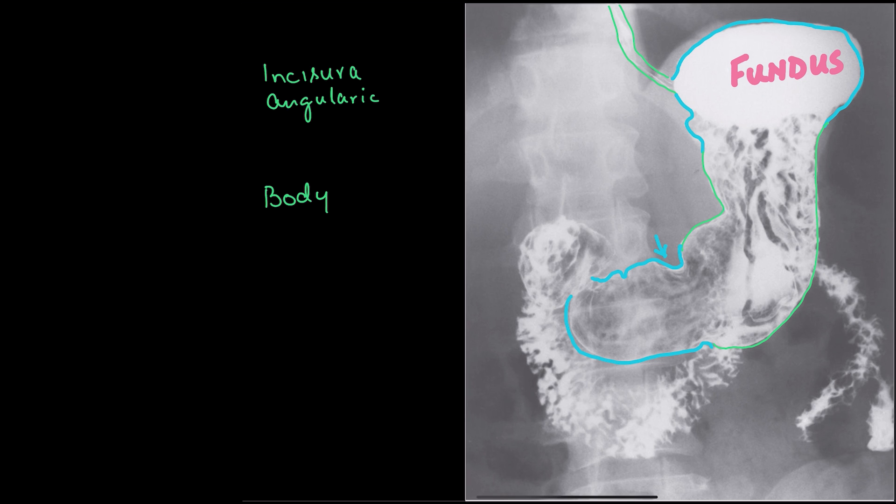You can very easily highlight the rugae and you can see these rugae are present in the body of my stomach and they are very nicely visible within this contrast study. This is the pattern of the rugae which has been widely scattered all across the lumen of my stomach.